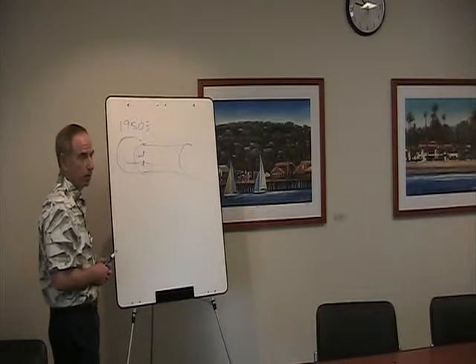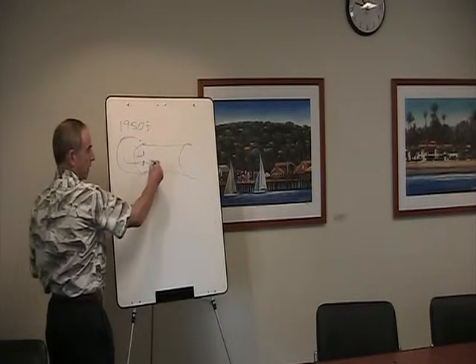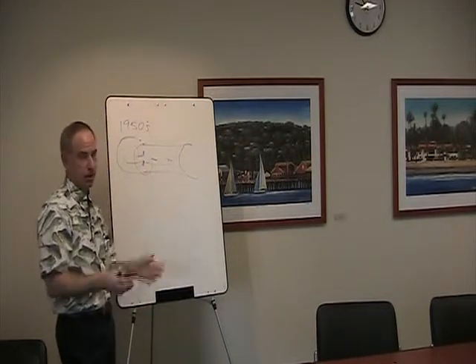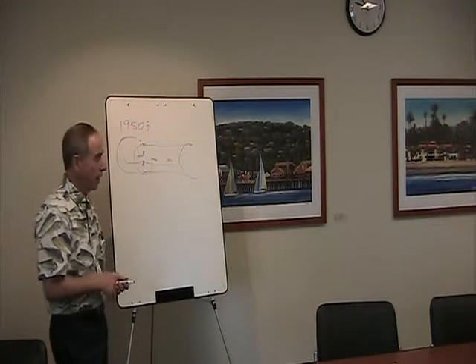And are they in there like all day, like 24 hours a day? Yeah. Inside that? Yeah. So there are little handholds here, so people can change them, clean them and stuff like that if they need to. And they're very comfortable.